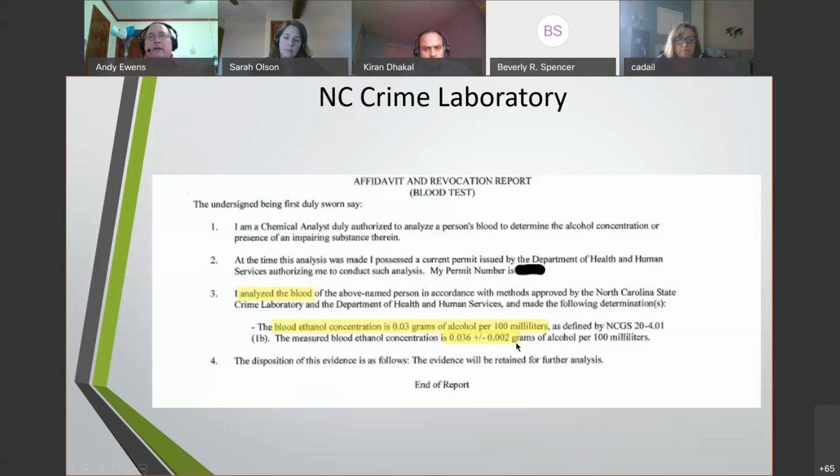So this is kind of nice where they're giving you the error rate. And you can use that if this was a measurement that was right near a certain cutoff. You can use that and see whether the cutoff between a positive or negative was within the error rate of that machine.